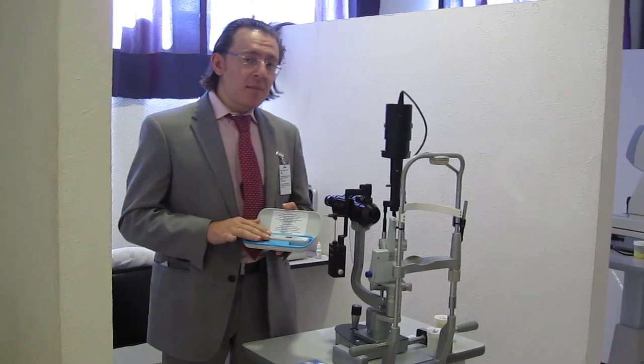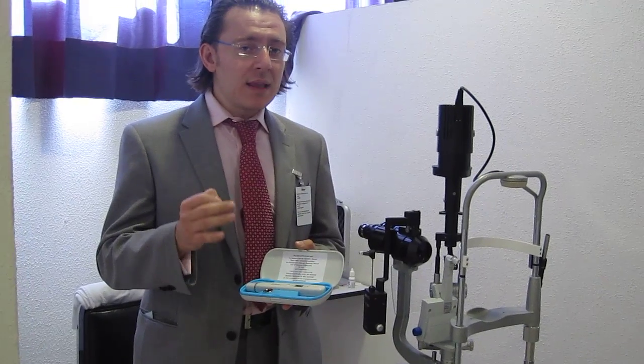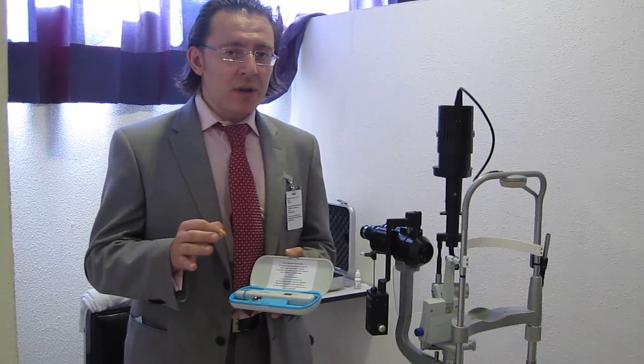The Diaton tonometer is the only tonometer which allows you to measure intraocular pressure through the eyelid and, more importantly, through the sclera. It's the only non-corneal tonometry where the readings you receive are independent of the biometric properties of the cornea.